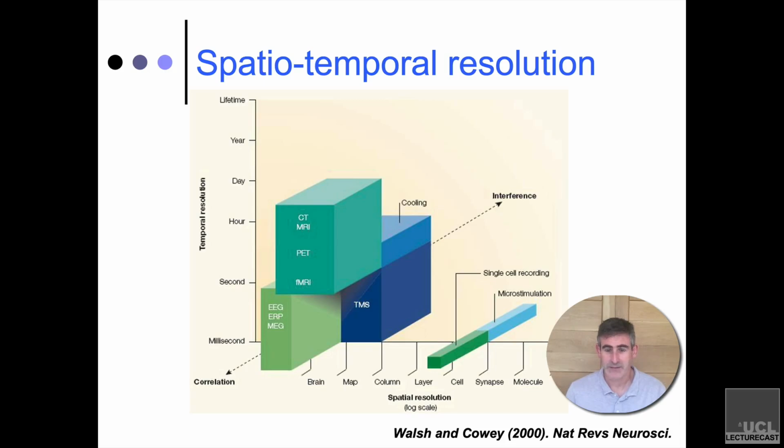Beyond that, you're losing enough signal that you can't be very confident in it. However, if you go over to the Phil, where they have a 7 Tesla scanner, then you can get down to the individual layers of cortex because there's so much more signal that you can benefit from the spatial resolution. It doesn't help you at all with temporal resolution because you're still measuring something that's about BOLD signal, and BOLD relies on blood flow changes rather than direct measures of neuronal activity.